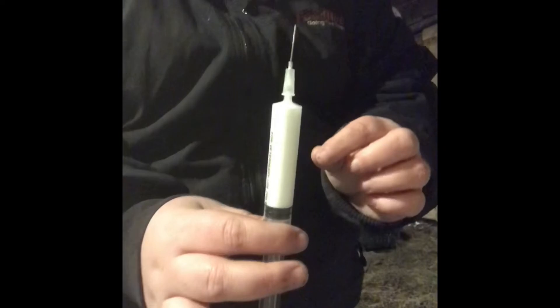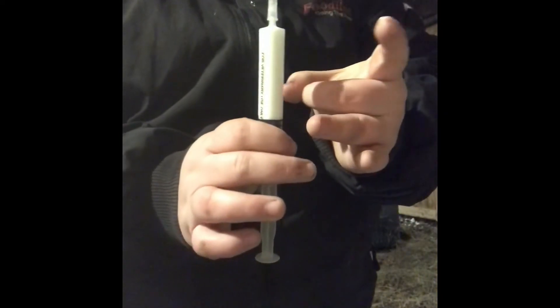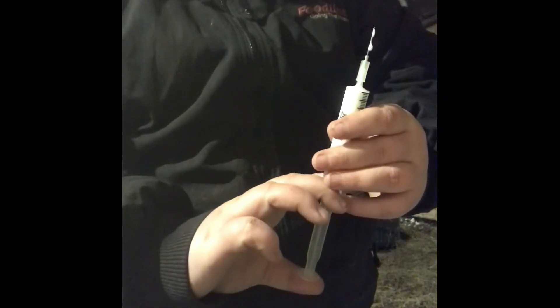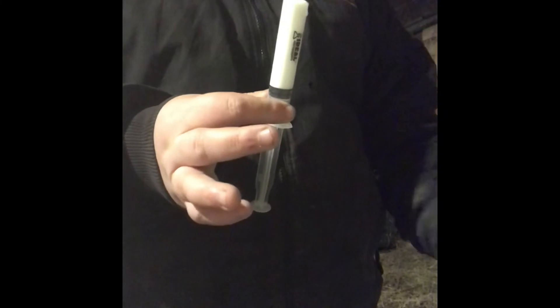In order to get the air bubbles out, you're going to go 1, 2, 3 and push it out just a little bit. You will lose a tiny bit of medicine, but that way you get all air bubbles out. You don't want any air bubbles going into the muscle — or even if you were going into the vein, which you do not want to do, you don't want any air bubbles at all.